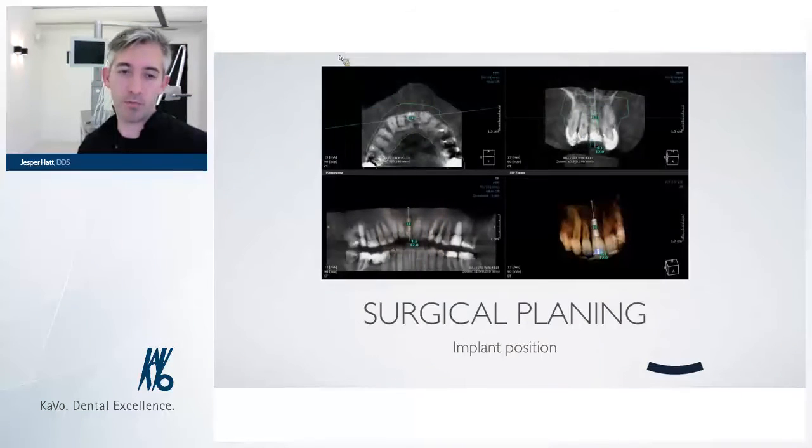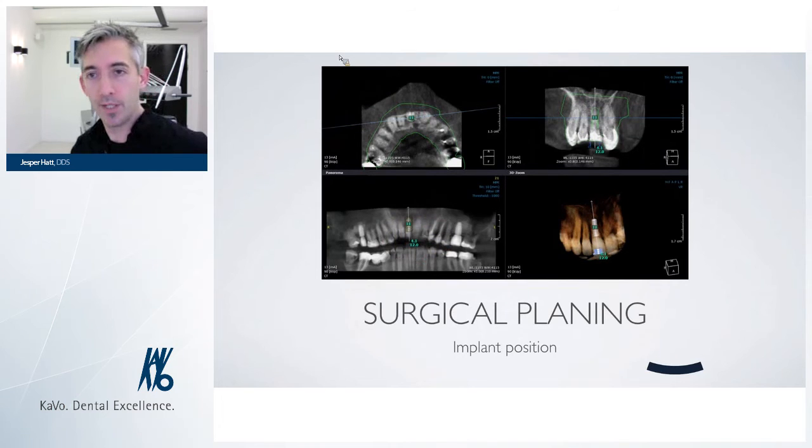So you can see we have all the different angulations in regards to our 3D picture. And again, it's really important for me to say that I like these systems, and I really like it when they're open systems. This plan was done with IntoGuide, which is an open software system for viewing cone beam images.